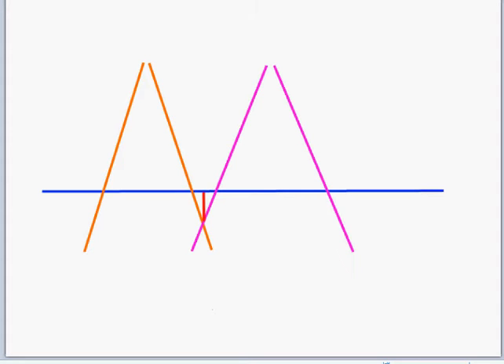All right, so now we're going to look at a couple more situations with gap calcs that you might see on a test. These are a little bit tricky, and so they might put this on a board exam or something if they're trying to see how well you know this. So here's a situation. We've got, again, two beams. We're going to try to match at a certain depth down there.